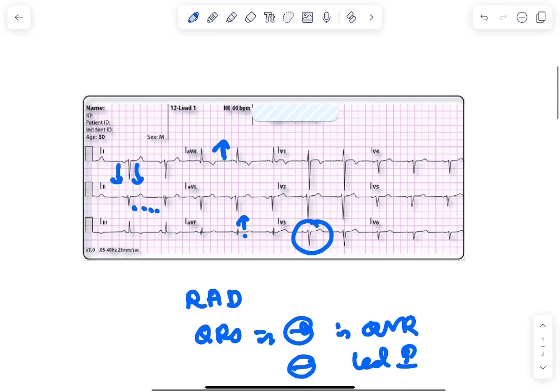Yeah, that's it. This shows dextrocardia. Let's meet with another ECG. Thank you.